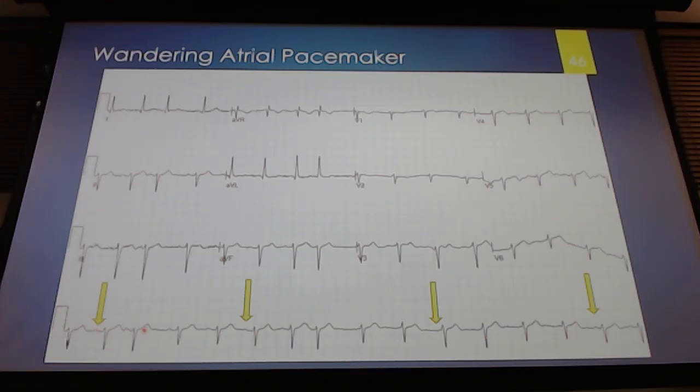Here's a P wave, here's a P, here's a P, here's a P, we got P's. Okay, but our P's, we don't even have a P here, no P here. Our P's are looking different. You can look up in these other leads as well. We need to really see it from that 10-second lead to identify that either we don't have P waves for some of these, or our P waves look different. 3 or more different morphologies of P waves.